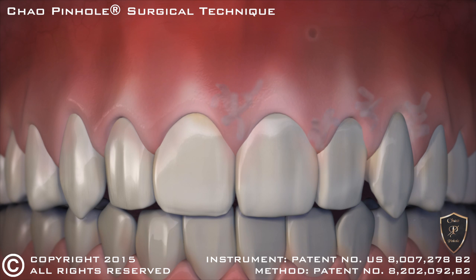When complete, the receding gums are corrected with a minimally invasive treatment that is quick, easy, and instantly pleasing.